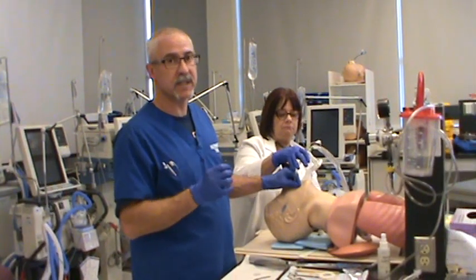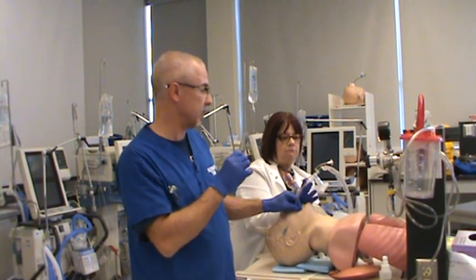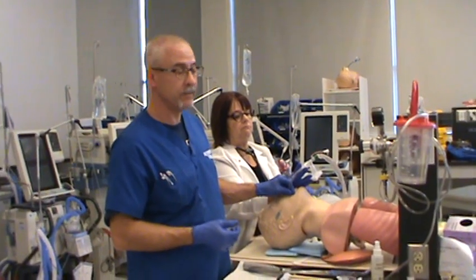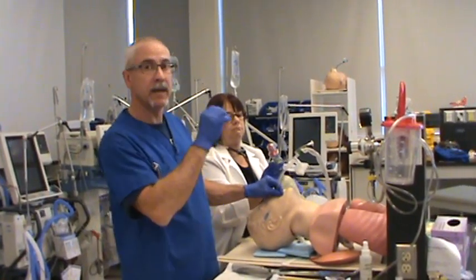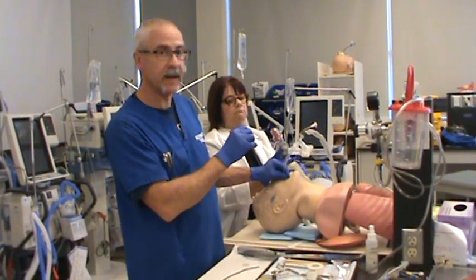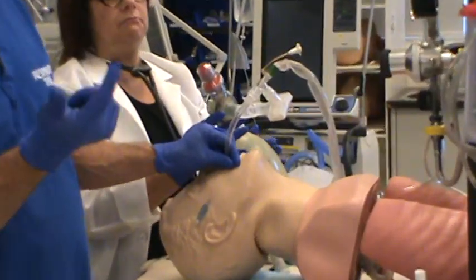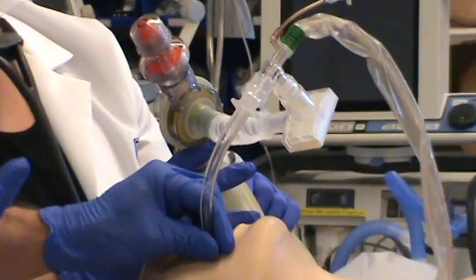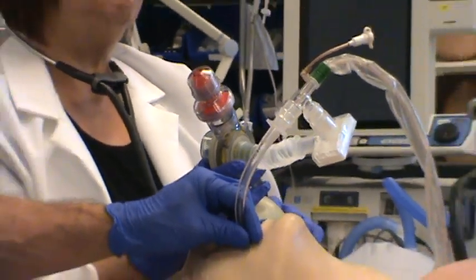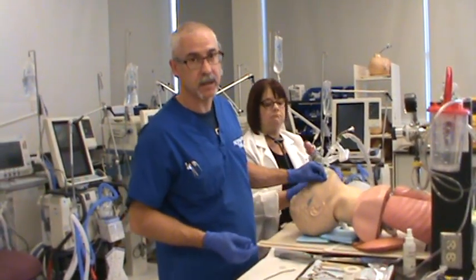When you've got that done, remove the stylet, inflate the cuff, and attach your manual resuscitator with your appropriate connection device. This one has the CO2 detector as well as the PEEP diverter and PEEP valve — I've set the PEEP at 5 cm of water pressure. Commence with ventilation, and with that first breath auscultate for tube positioning, ensuring the tube is in fact in the trachea. Check that the chest is rising, listen over the stomach, listen over the patient's lungs with your stethoscope, check your end-tidal CO2 device for color change or a visual number, and check the condensation inside the endotracheal tube.